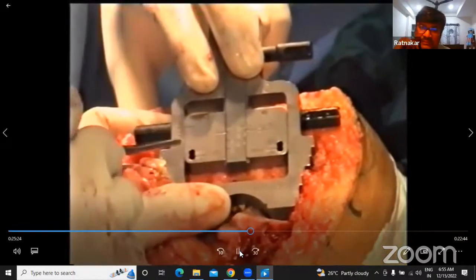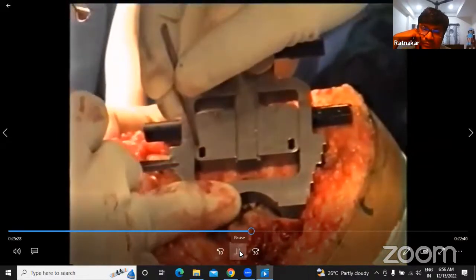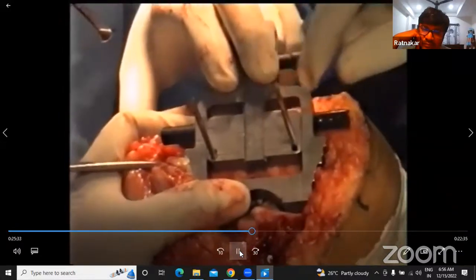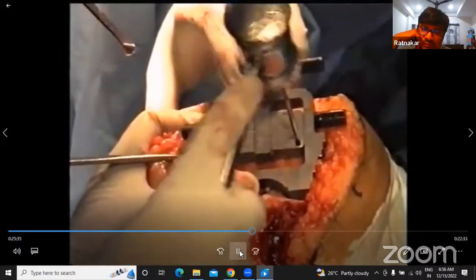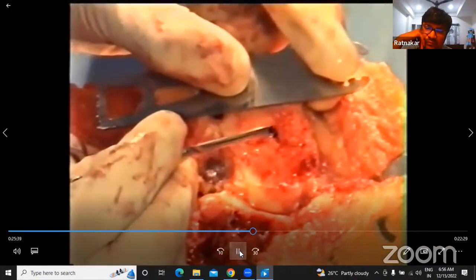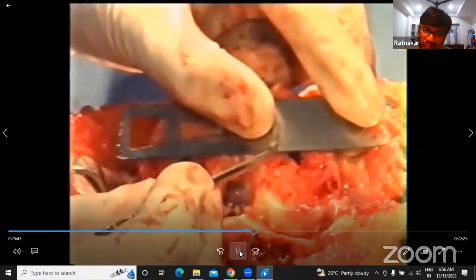And this is the right medial hole, like that. This is the left medial, left lateral. Right, okay. Now we are going for the right lateral, and that is the right medial. So that means we are putting the holes in 3 degrees external rotation. Those are the holes we made for going to the axis. I am connecting these two holes.